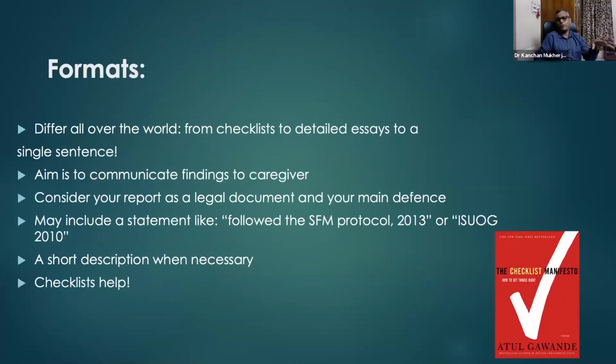Now there are various formats. Formats differ all over the world, from a checklist to detailed essays to a single sentence even. Like after doing a half hour anomaly scan, one would say, no obvious fetal anomaly detected, end of it. That's not enough. So you need to know what is the best format to suit you.